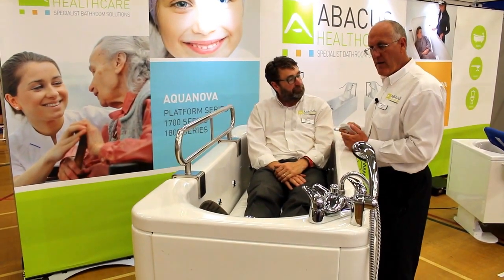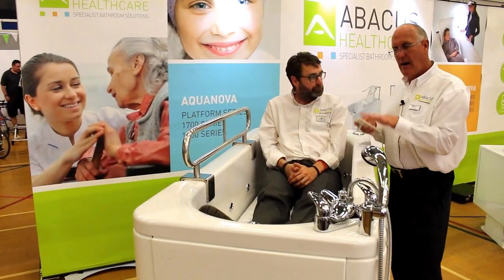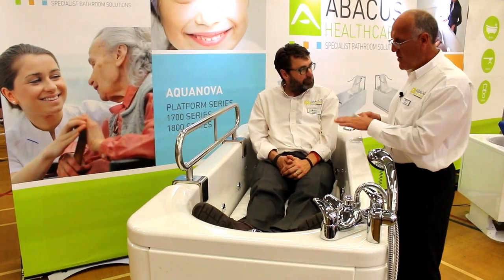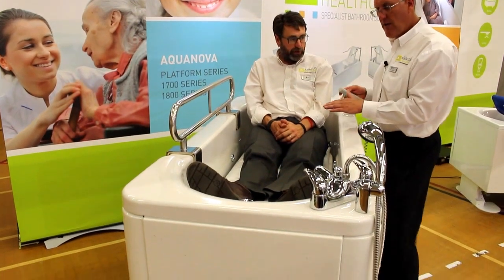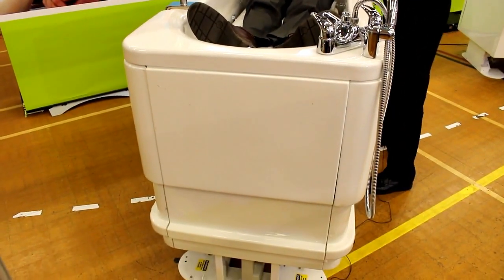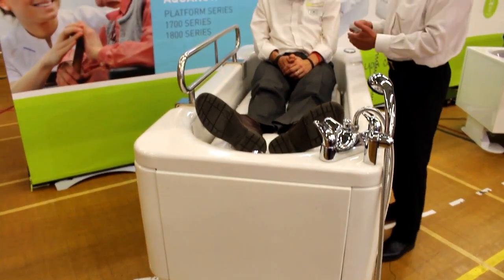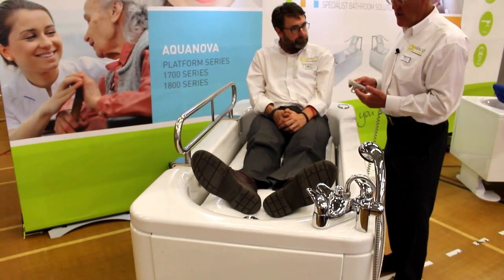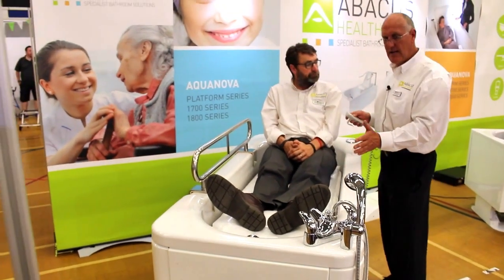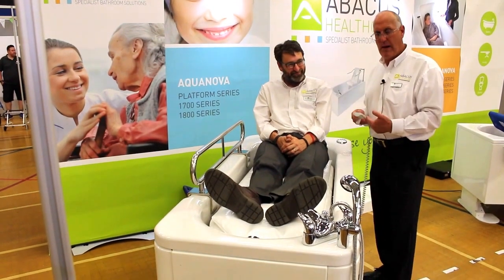At the end of the bathing session what I could decide to do is actually just take the water level away. I don't have to pull the plug — I just reduce the level of the water, and if you notice Bob is actually staying at the same level, which is correct for me to actually care for Bob. The benefit of this is: one, the water is going to be out of the way; two, I can put the sling on at the correct height for me to manage; but also I can dry Bob without having to reposition him or wet the hoist, wet the floor, or wet myself.